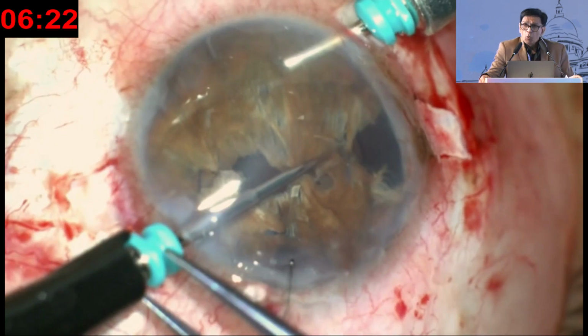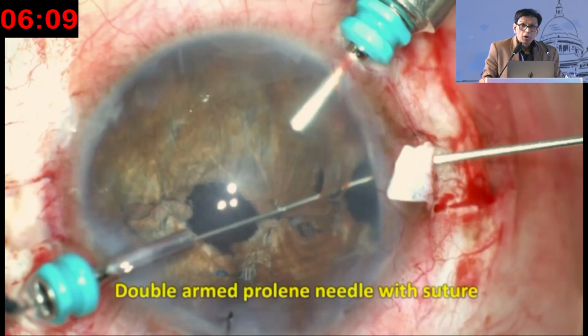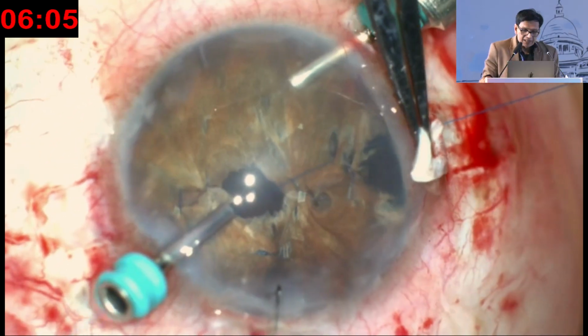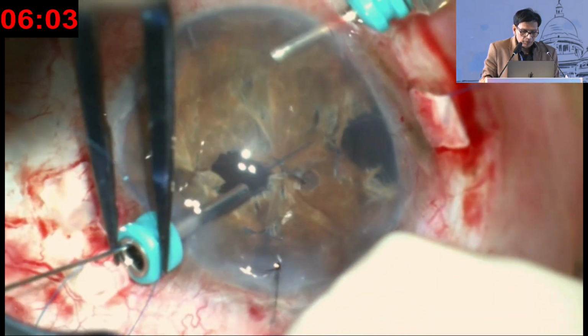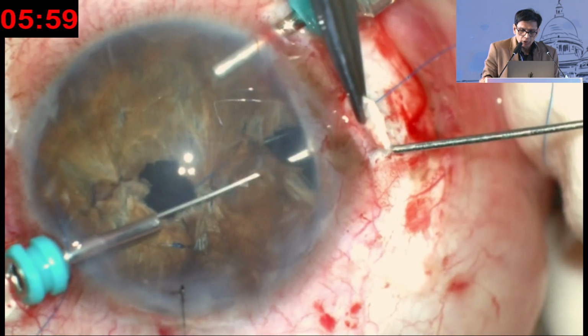But now once you have that, I have to do a trocar assisted iridodialysis repair like how Rohit showed you. So where is the trocar fixed? Right opposite the area of the iridodialysis. Now you take a double armed Prolene suture that goes through the iris, comes out through the sclera. That's the one arm. Then the second arm goes through the iris again, comes out through the sclera.